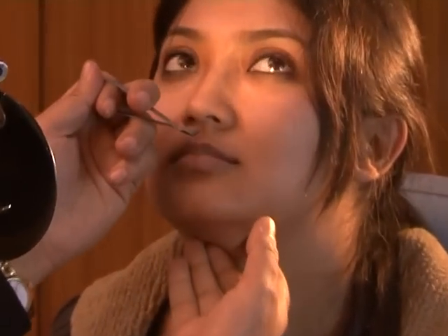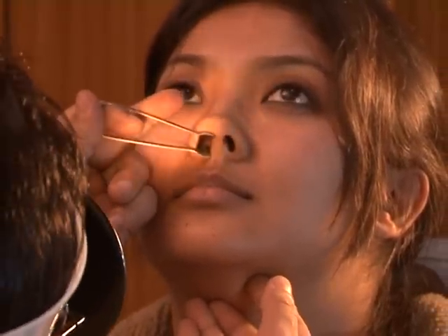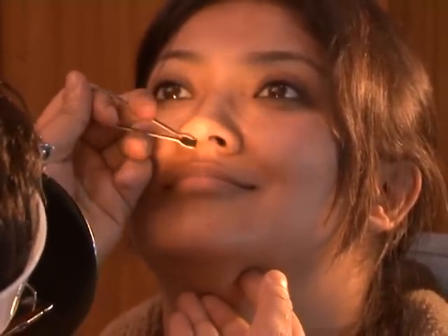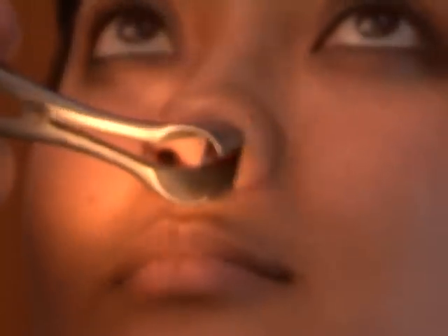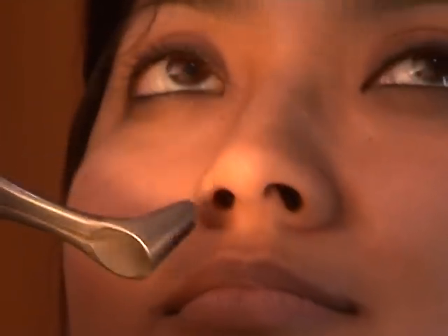Anterior rhinoscopy is done using the Thudicum speculum, held in the left hand keeping the right hand free for other instrumentation. The speculum is introduced with the blades closed, then gradually opened inside the nose to avoid discomfort. We then examine the roof, floor, lateral and medial walls of the nose, and the septum. The inferior turbinate is well seen; the middle turbinate is seen with difficulty. The middle meatus is situated higher up, so the head is tilted backwards at 45 degrees.